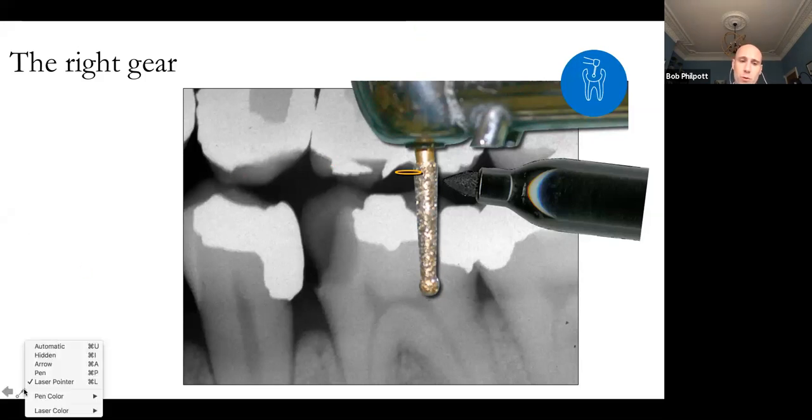But if you're going to turn the water off, you need really good suction because it smells pretty unpleasant, and you are at some point going to also need to put water on because you've got to clear away that debris. So trying to take an amalgam out, for example, with no water on, again, is false economy, because you'll think, oh great, I can see loads because there's no water, but you can't, because it just creates that massive amalgam sludge, and you can't kind of see your way through it. And I think that that is difficult.